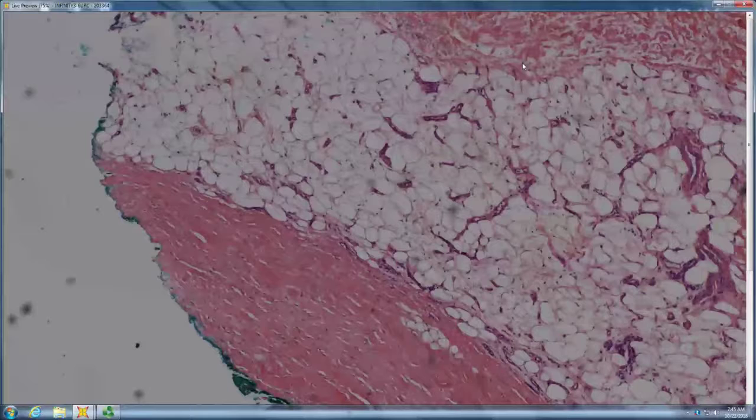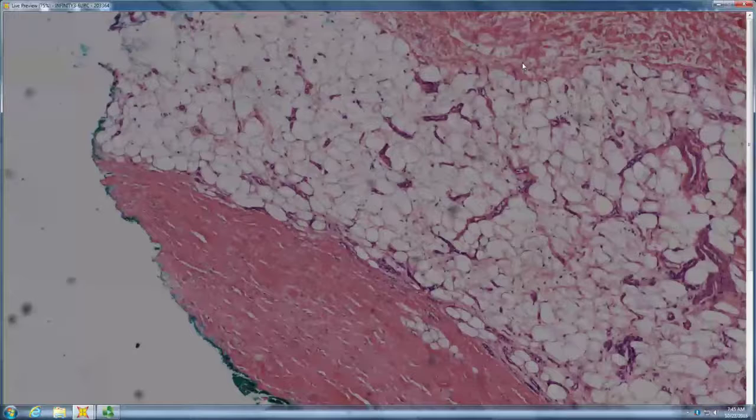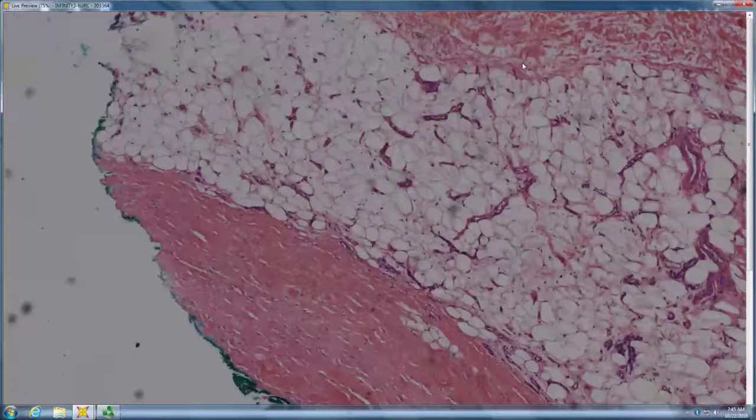it's something sclerosing, because this was a patient with graft versus host disease and late sclerodermoid GVH, right? So GVH can have an interface phase and then the sclerotic phase, and you could go through this and kind of pick it apart and say, well, probably not radiation because of the retained adnexal structures and the lack of elastosis and radiation fibroblasts and ectasia. Probably not morphea because of the prominence of the interface change. Probably not LS because of the deep sclerosis. So you go looking for the clinical and something different.